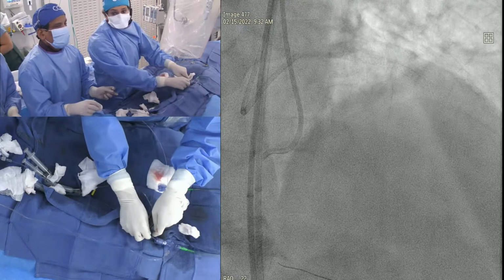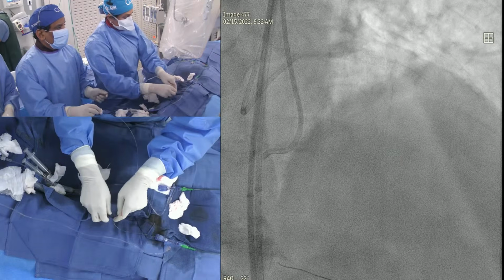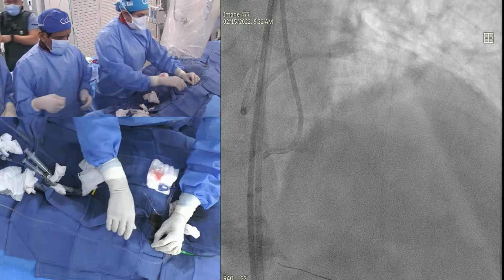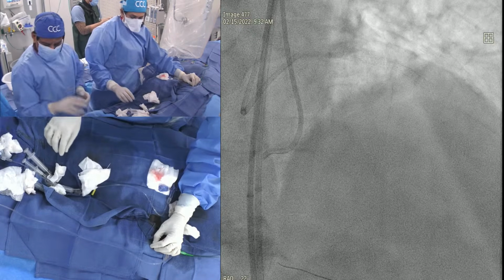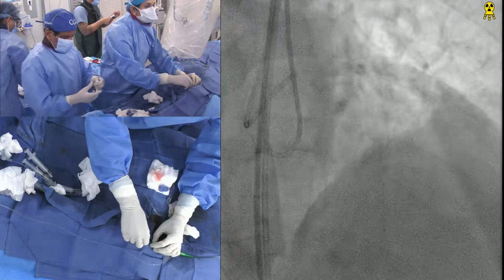Dye, $150. Okay. And Anu, how much was the ACT? About 270 still. Okay. Good.